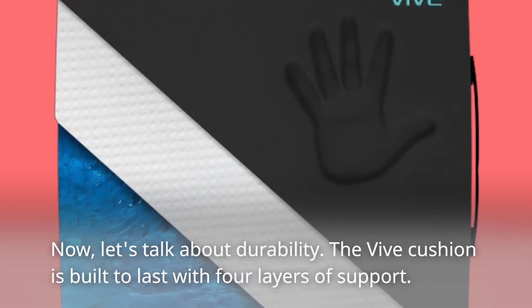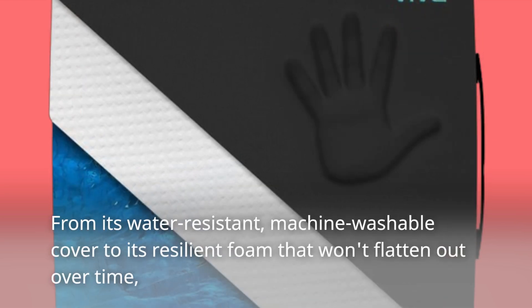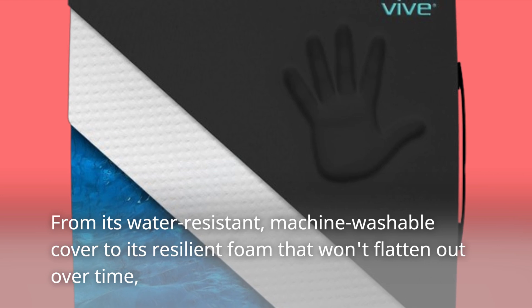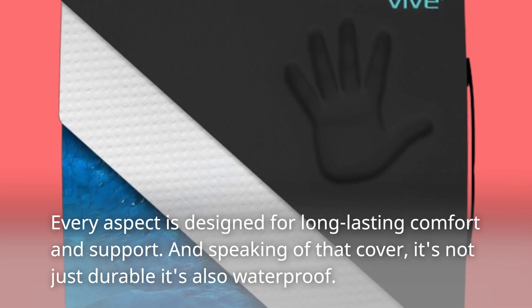Now, let's talk about durability. The Vive Cushion is built to last with four layers of support — from its water-resistant, machine-washable cover to its resilient foam that won't flatten out over time. Every aspect is designed for long-lasting comfort and support.